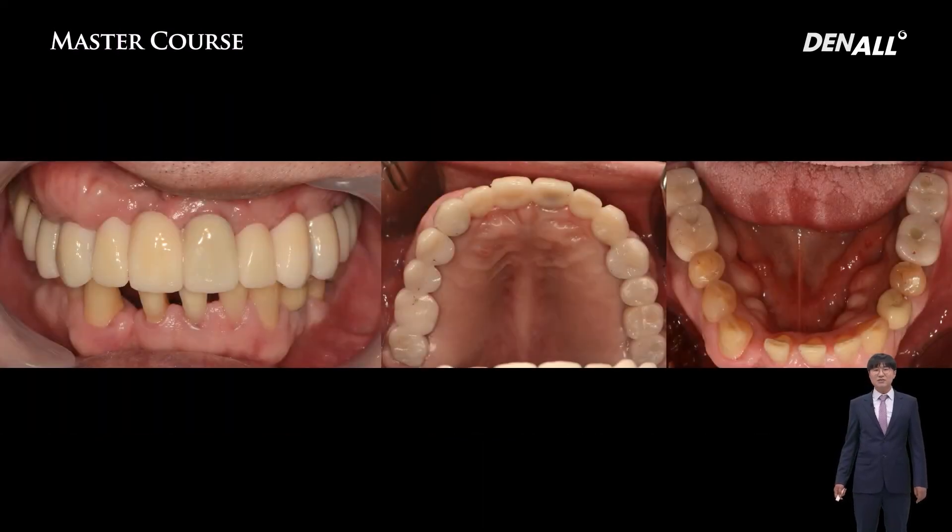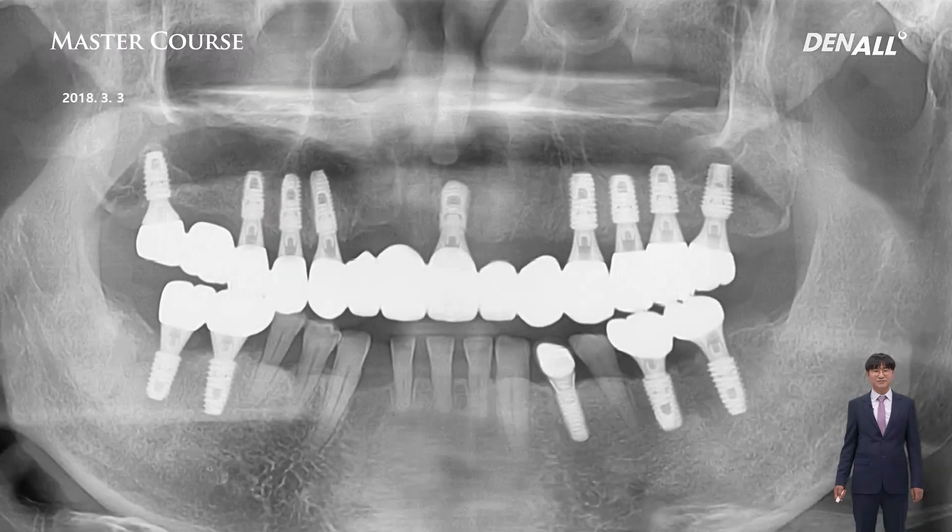It is regrettable that the abutment metal color is showing in the upper anterior. The final prosthesis was completed, and here is the final panorama image.